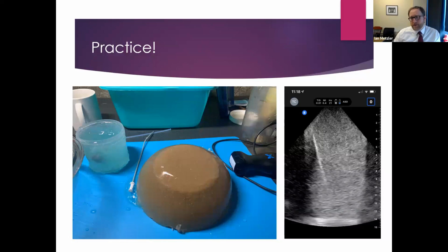Well, if you're able to place a nephrostomy tube under ultrasound in the emergency room or wherever you're doing it, you're far ahead of many American urologists in terms of their ability to use ultrasound to get needle access to the kidney. So in terms of the skill sets you need in addition to do the PCNL, it's not much. It sounds like it's really resource dependent, getting the right scopes and lithotripters. So that's great, because if you have that skill set already, you're halfway there.